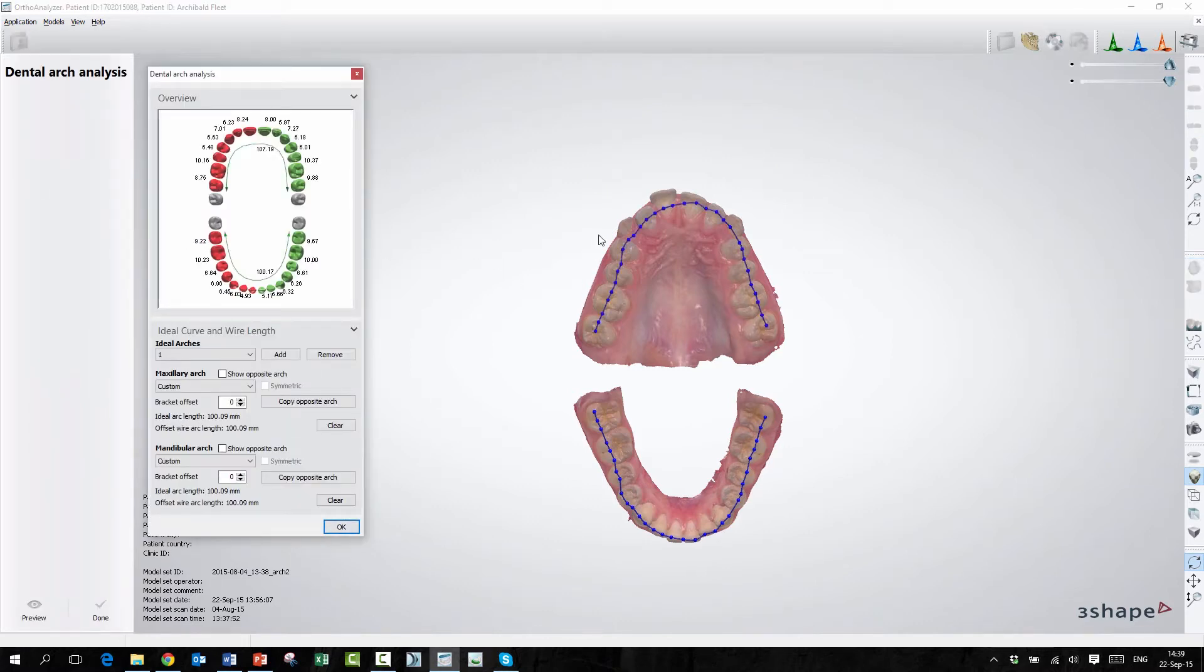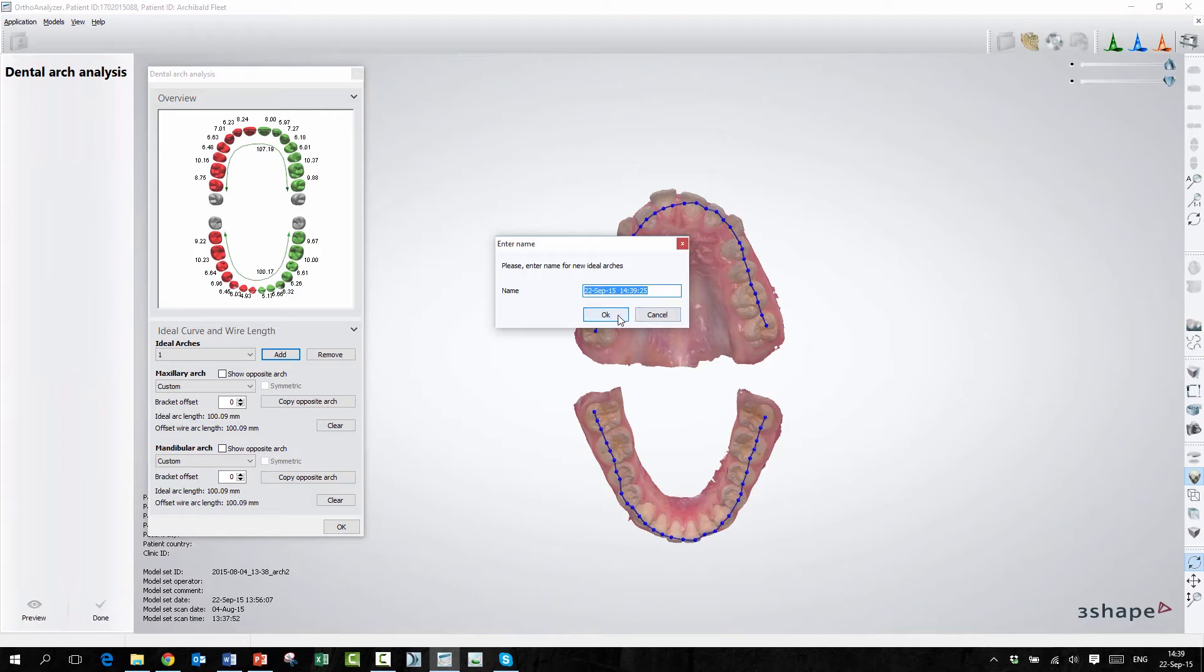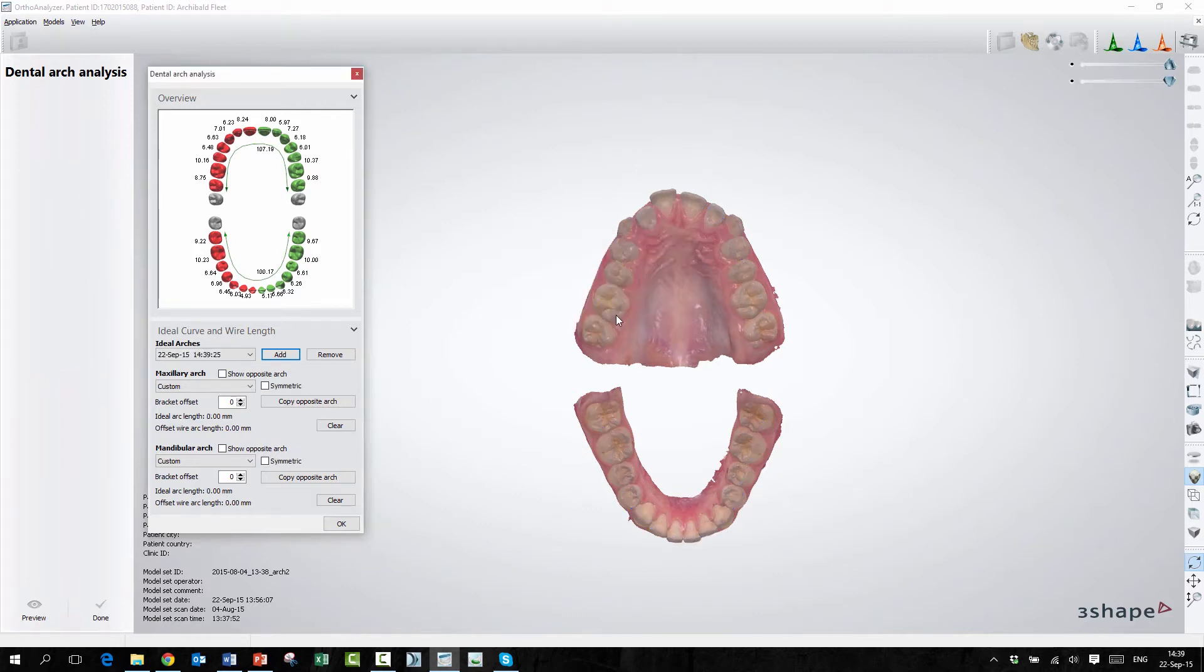As you can see here, I already created an arch, but to create a new arch, I only have to press Add here. I will give the arch a name, or you can just keep it. It will set the date and time and you can also keep that on. So it puts that in automatically, basically. Exactly.